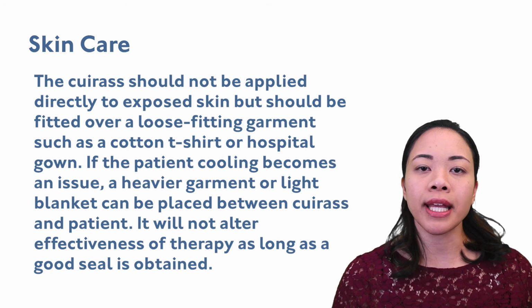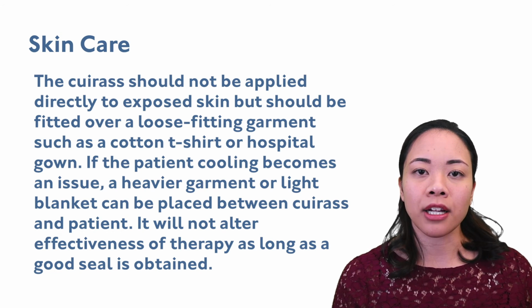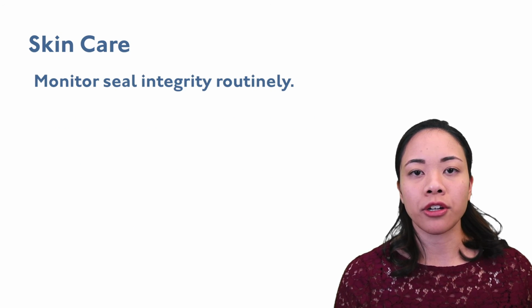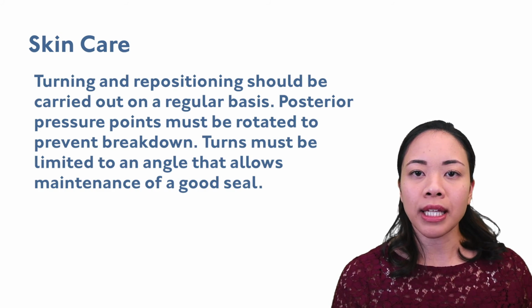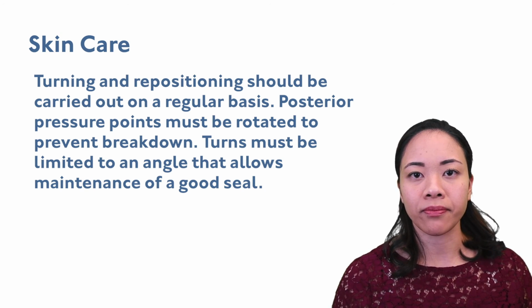The Cuirass should never be applied to exposed skin. The manufacturer recommends that a cloth barrier be used, whether it's a shirt, blanket, or hospital gown. The seal integrity should be monitored as well. If the foam is starting to break down, it is advised to replace it with a new seal. As with any respiratory device, the patient's skin should be checked regularly.